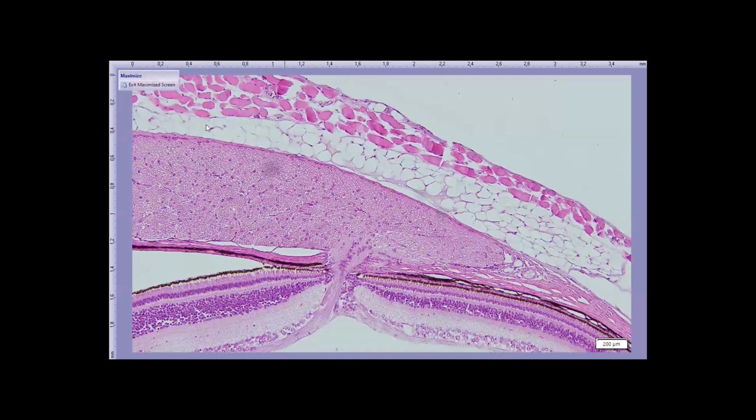That rings a bell. So using the principles that we talked about, diurnal versus nocturnal retina, there are lots and lots of ganglion cells, and the outer nuclear layer is relatively thin, making you think that it has a large amount of cones and not so many rods.